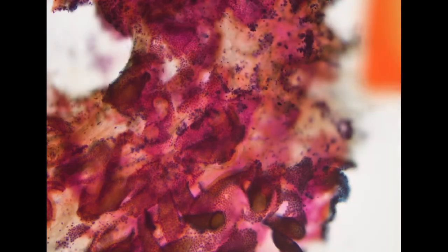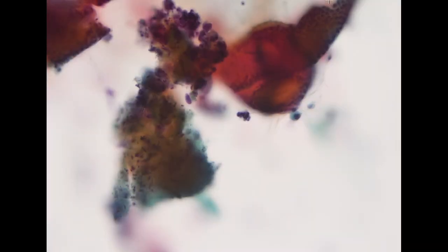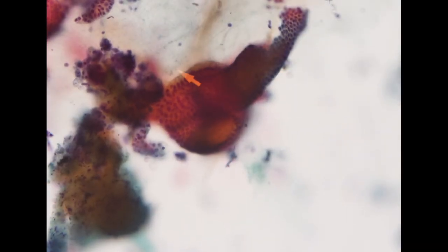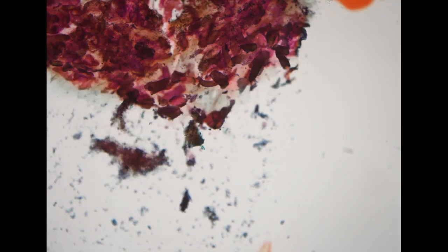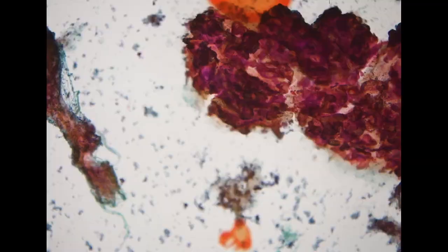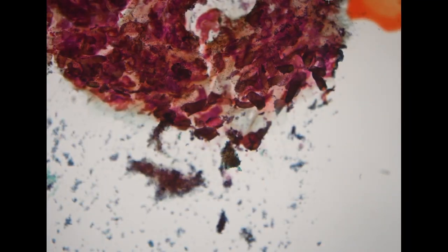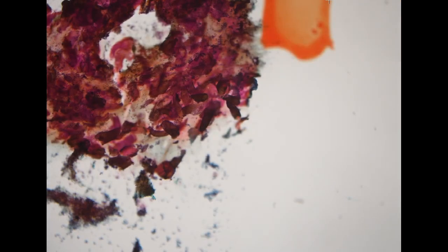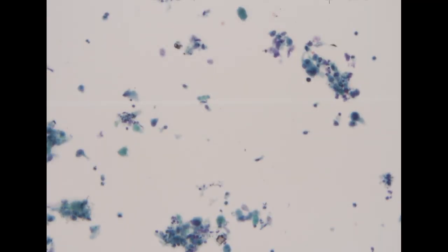The specimen was taken through the gastric, the stomach, and you see some like orangeophilic mucin lining and with this nice honeycombing architecture. So these clusters are all contaminated gastric mucosa, okay? So you see foveolar type of gland and with these large, like a cohesive, nicely arranged honeycombing fragments. So this is a large chunk of a gastric mucosa contamination. So this is not something that we are looking for.